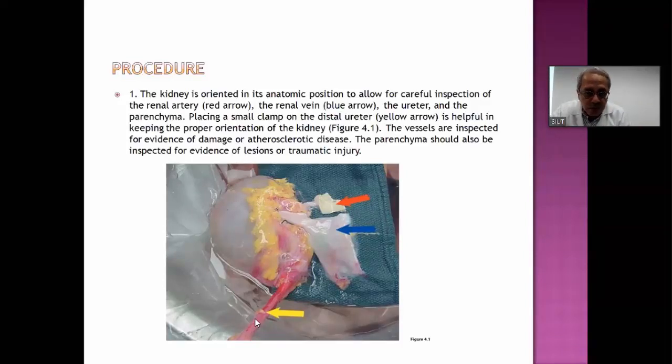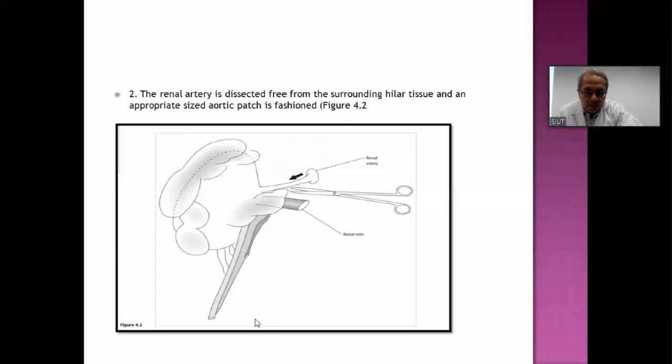This is not something which can be overlooked, because the whole surgery depends on blood circulation and the anastomotic line, and we have no place for thrombosis. So this has to be kept in mind very clearly. So you please proceed.